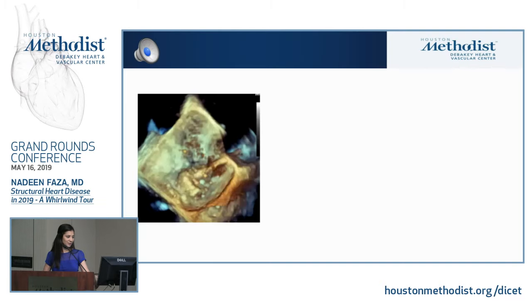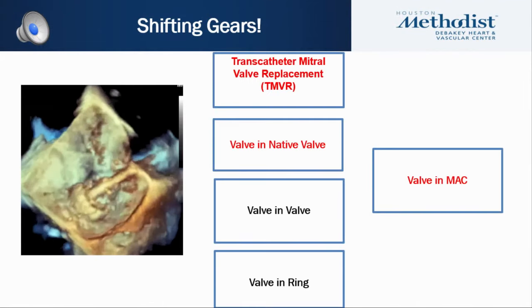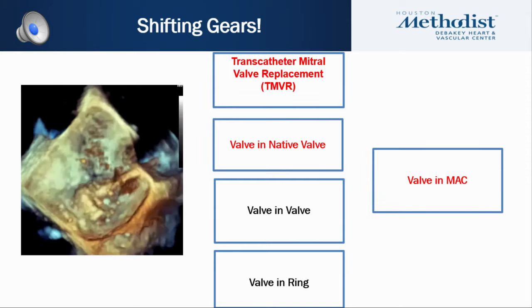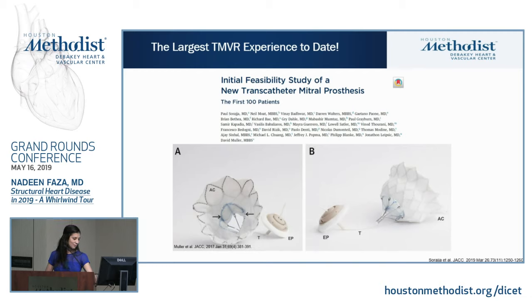All right, shifting gears. We're going to talk about transcatheter mitral valve replacement, including valve-in-native-valve and valve-in-MAC. Recently, the largest transcatheter mitral valve replacement series experience has been published. And this was the initial feasibility study of a new transcatheter mitral prosthesis, the Tendyne prosthesis by Abbott.